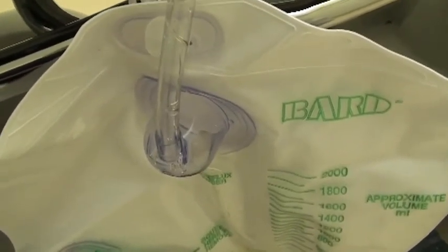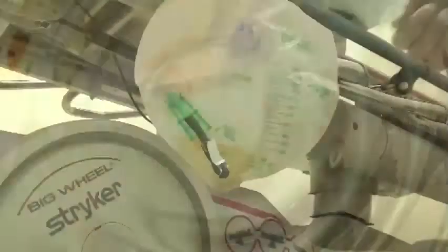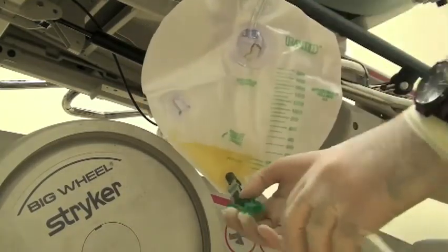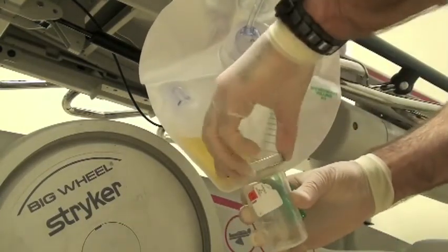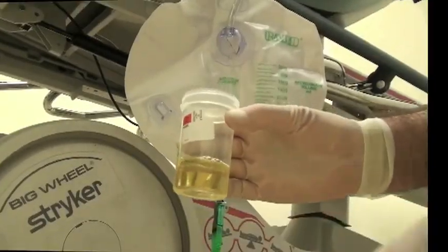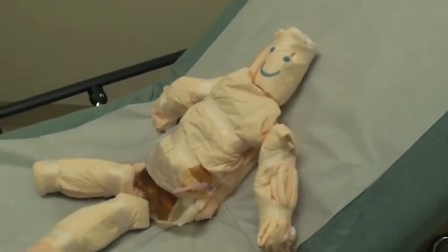The great thing about this is that you can see what volume you're collecting in case you don't want to take off too much fluid. It's also a sterile system so you can easily open it up and take out some fluid to send to the lab for whatever test you want. And look at that — our poor patient who was so unhappy before is now happy. Isn't medicine rewarding.